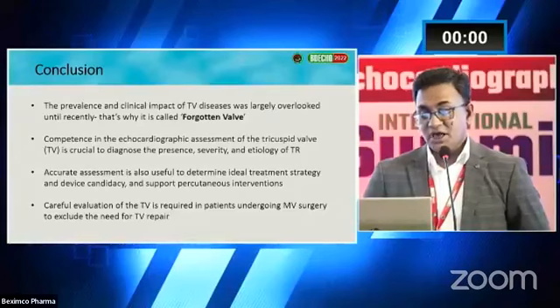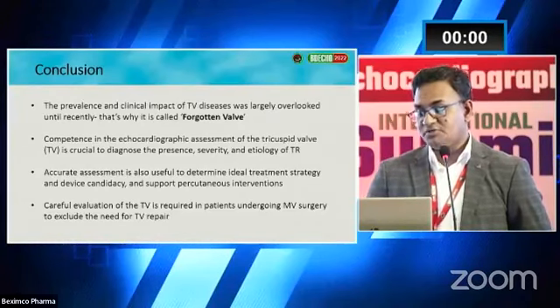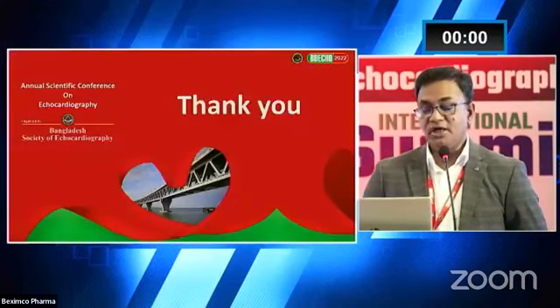And lastly, careful evaluation of the tricuspid valve is required in patients undergoing mitral valve surgery to exclude the need for tricuspid valve repair. Thank you for your patient hearing.